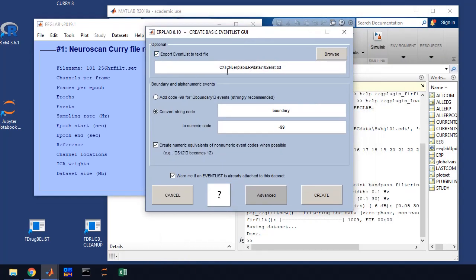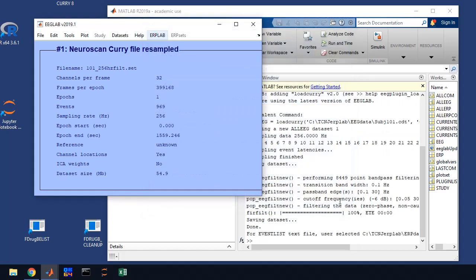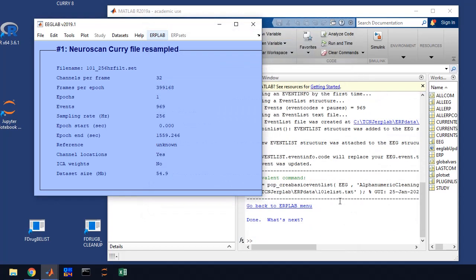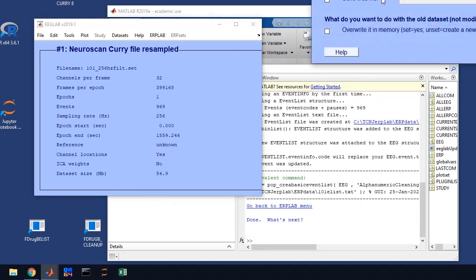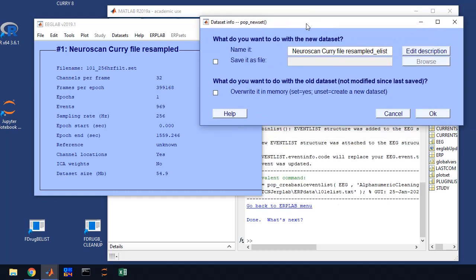You'll get this box that will pop up. And what you're going to do is you're going to export the event list to a file. We're going to name it by the subject number. So it's going to be 101 and then elist.txt. This is all in your protocol, but you're going to type in the subject number there and you'll click create. Now what that does is that creates an event list file for this data set.